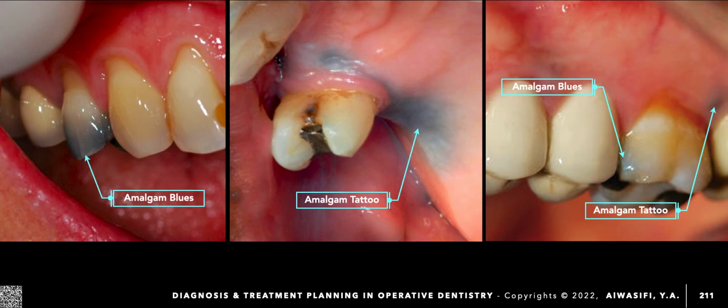Again, unless the patient needs to improve his aesthetic, okay, then you do not need to replace your amalgam. In general, manual amalgam proportioning and trituration is extremely limited or nearly nil nowadays, okay, and all the amalgam available, either for safety procedures from the risk of free mercury or whatever the cause, is available in the form of capsules, which is easier, more convenient and safer when you are using amalgam restoration.